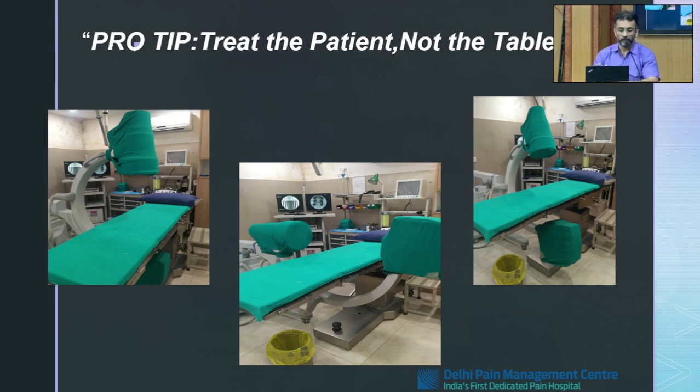Now, there are three basic images: one is AP, one is lateral, another is oblique. Now, the C-arm position or the table position will not decide the AP. This is a common argument that I have with my technician, who says, sir, it is showing zero. But zero does not cater for this, because there is obesity, positioning, skeletal deformities and a lot of other things.